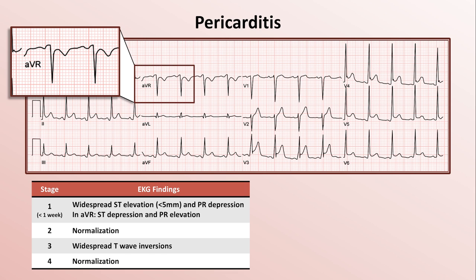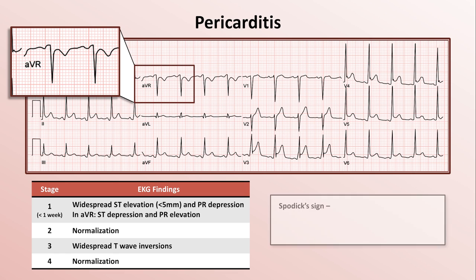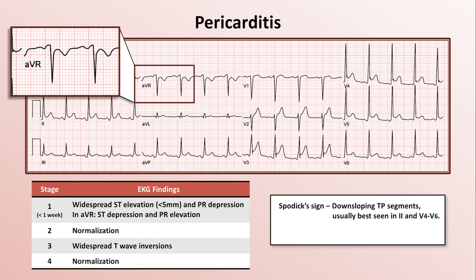In addition to the classically described stages, an interesting finding called spodic sign has also been described in pericarditis. This is the finding of down-sloping TP segments, usually best seen in leads 2 and V4 through V6. In this EKG, it's particularly evident in V4. This finding can also be seen in acute MI.